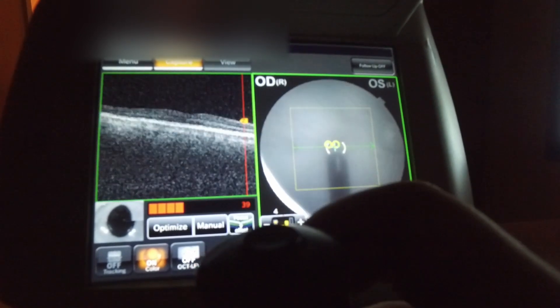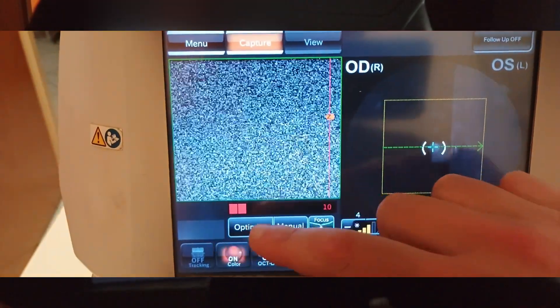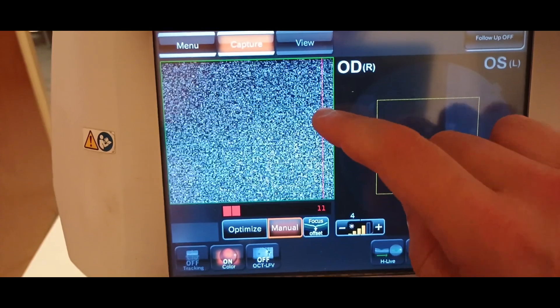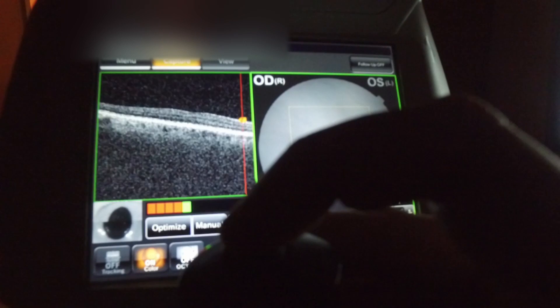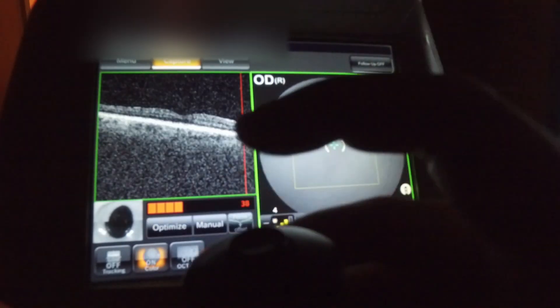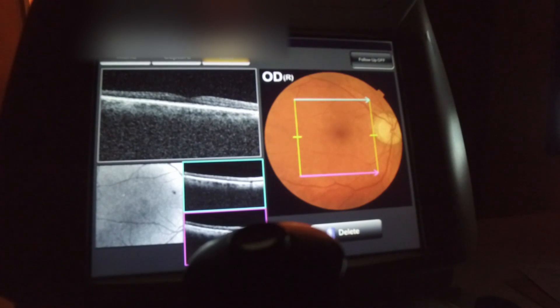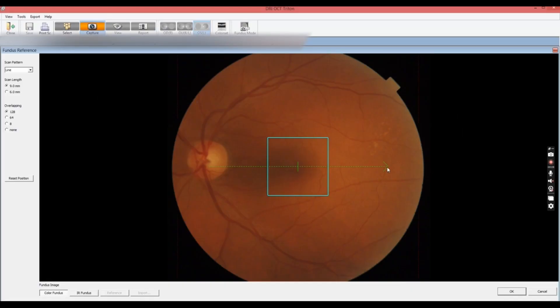When you take an image, there is no SLO — it's all done using the infrared. The machine will always try to optimize by itself but you can do it manually as well, and when you're satisfied you just hit the joystick. The machine then takes an OCT image together with the fundus photo, and then you can review the image and delete if you don't like it.